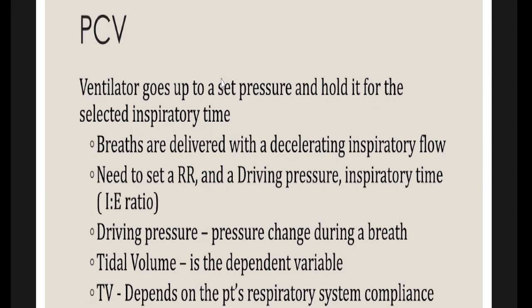The tidal volume is the dependent variable, because when we set a pressure, the dependent variable will be the tidal volume, because based on the driving pressure and the lung compliance, the amount of volume that is delivered will be different. That's why the tidal volume will be the dependent variable in pressure control ventilation.